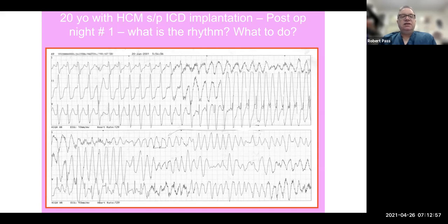What if I told you that during generator change, we actually induced tachycardia and the device properly sensed and defibrillated the patient? Because that's actually what we used to do. On every single generator change and in every single new defibrillator, we used to always check a defibrillation, well, we wouldn't call it a threshold, but a margin test, to make sure that there was at least a tangible safety margin between what the device can deliver and what was actually needed to defibrillate the patient, and the max of the device, of course, and also that the device could sense.